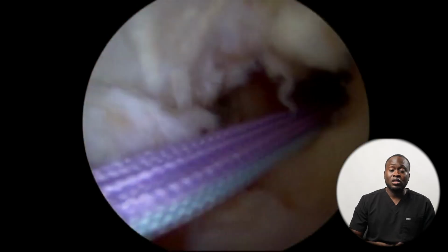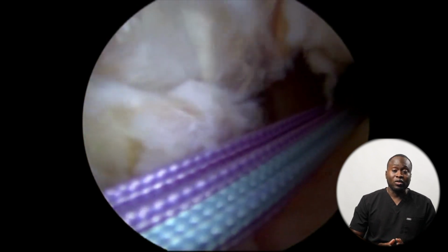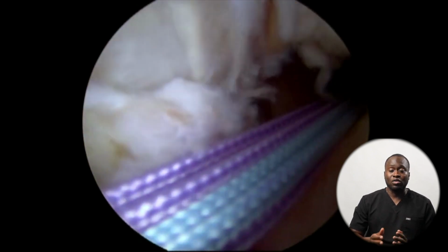And we're trying our very best to recreate what we call the native anatomy, to recreate what you had before you had the injury and give you an ACL as close to, maybe not identical, but as close to what you had prior to the injury. So once we drilled these two tunnels and we got them set up, the next important thing is to pass our new ACL through that.